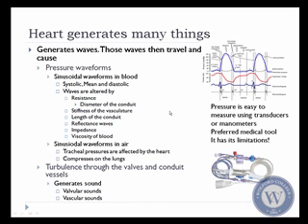Pressures are easy to measure, and that's why we use transducers or manometers, which are the preferred medical tool. The problem is that it has limitations, and I think one of the unfortunate things is that we don't get trained well enough in our career about the limitations of just monitoring pressures.